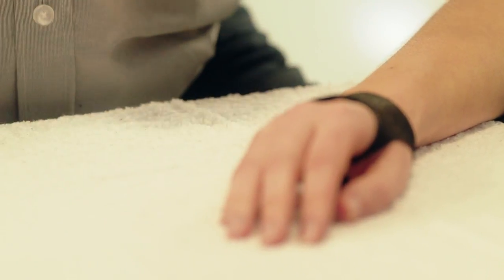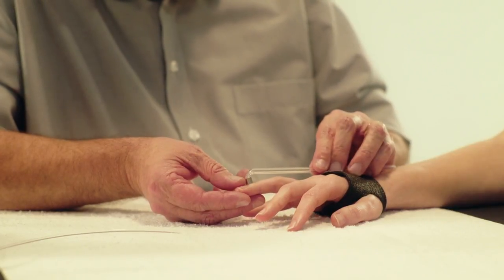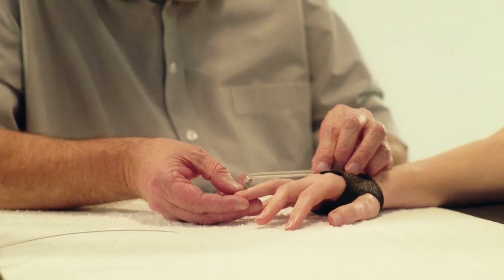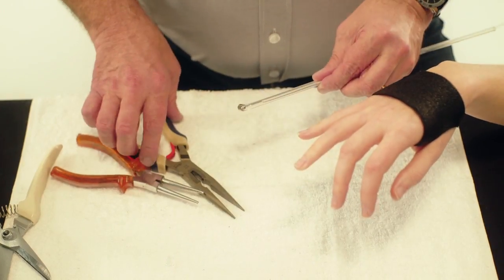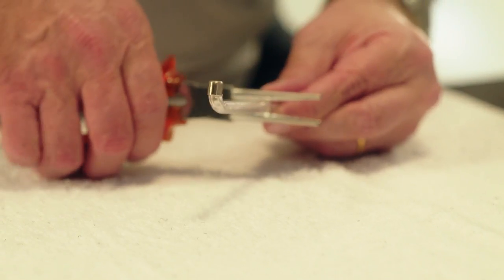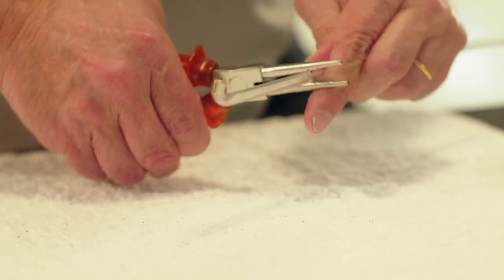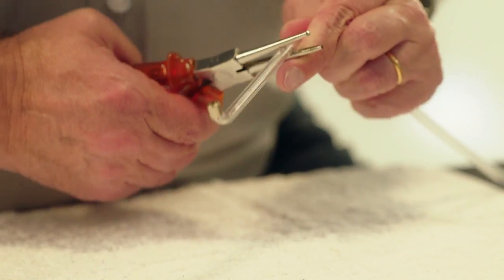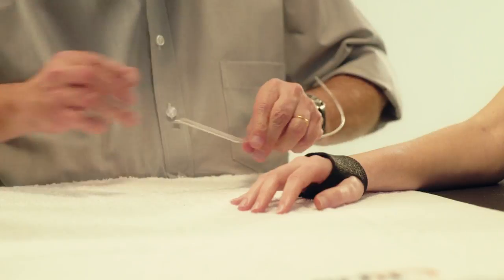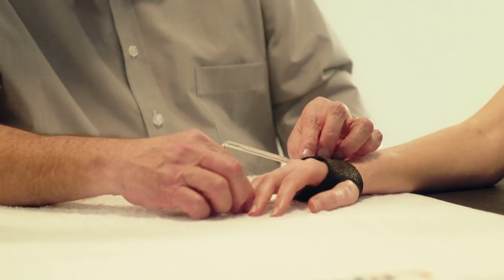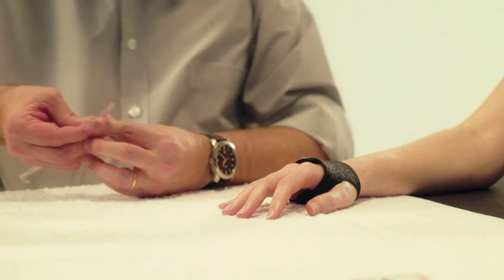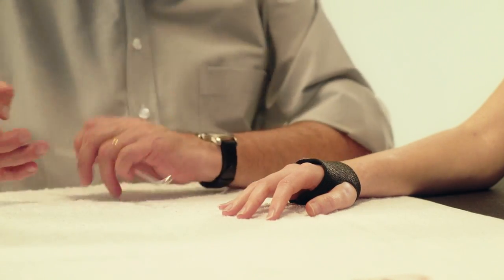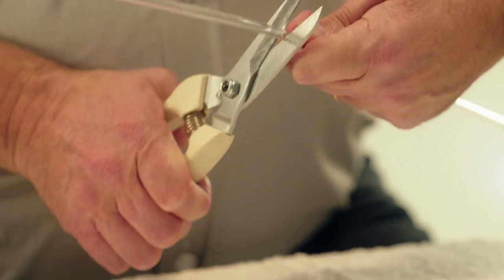Calculate the length of the tube. The length should measure from the proximal part of the orthosis to the dorsal DIP joint crease. Bend an extra angle in the Orphi tube above the MCP joint head using the guide and the strong pliers. Cut away the excess length of the tube after removing the guide.